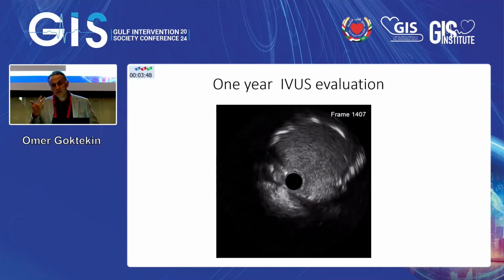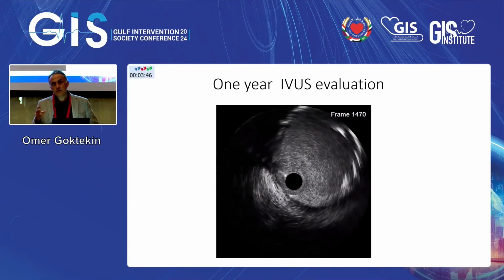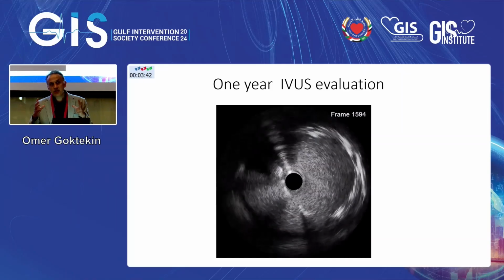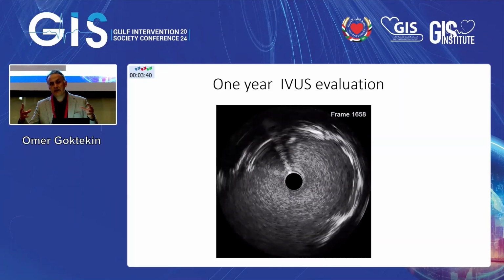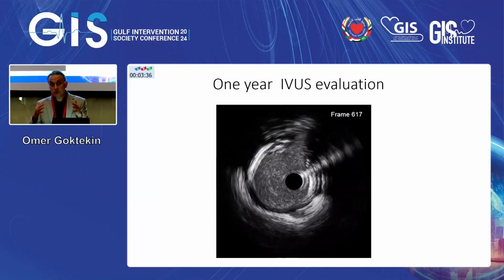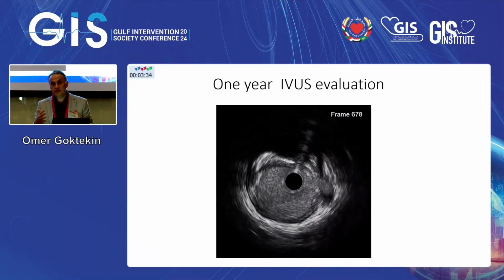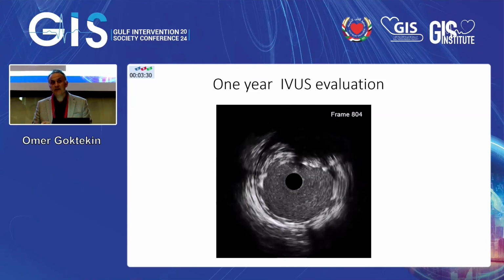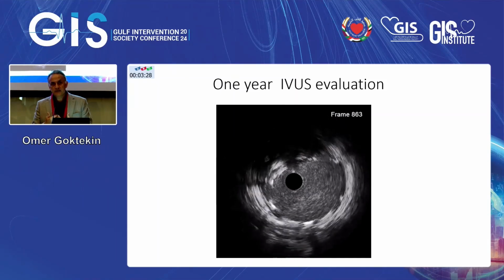If we have a Bioadaptor, and that part is no longer caged, then it will be easier to expand that stent after 6 months, because if there is no link between struts, we could expand. Otherwise, it will be very difficult to expand an underexpanded stent, right?